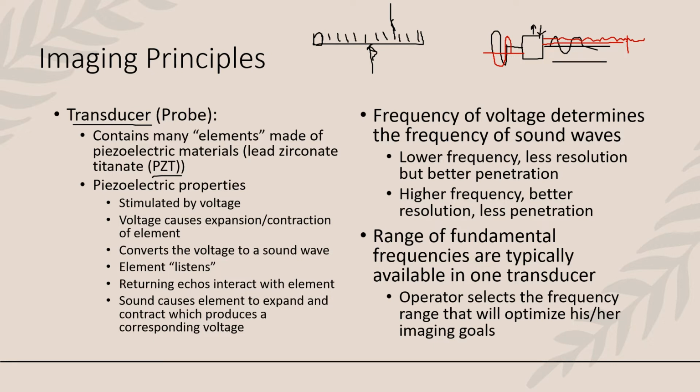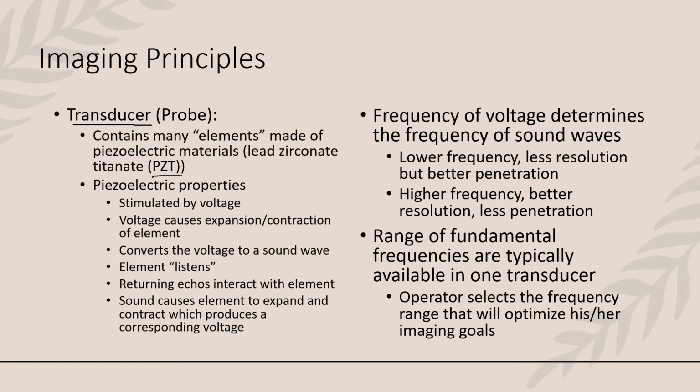The frequency of the voltage is really going to play a large role in the frequency of the sound wave created. If you're not already familiar with this, you'll find out that higher frequency sound waves get attenuated, or absorbed, in the body more. So if we have a nice skinny little patient, or we're scanning something very superficial like a thyroid or a carotid, my sound wave can go in. Even if it's high frequency, it will make it to the back field and it will be able to come back and provide some diagnostic information to our transducer.